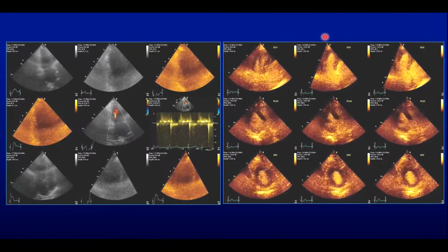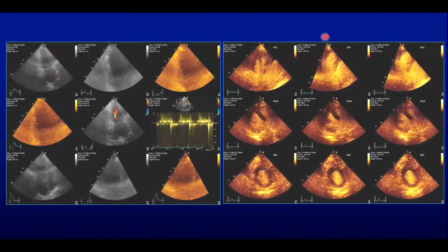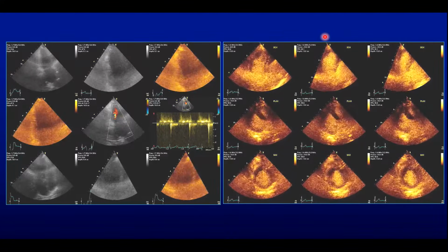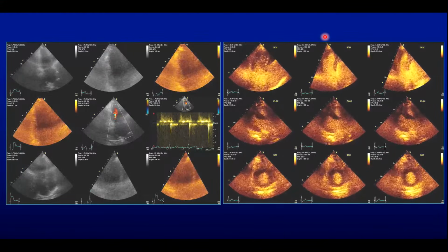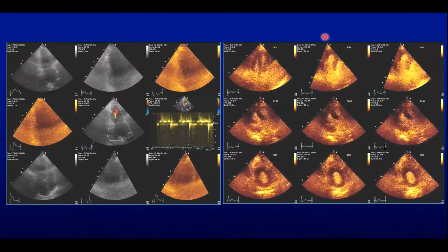It is inappropriate. Because from a reimbursement point of view, it's the same reimbursement if you've done it yes or no. But just imagine if you can't interpret anything. Now, there are some situations where you can't interpret despite use of contrast. But I think it would be inappropriate nowadays for you to be able to do that and not use contrast for those indications.